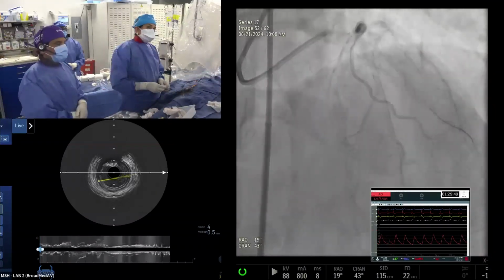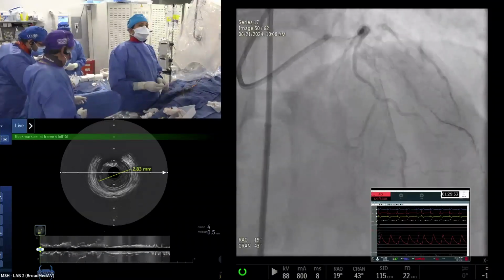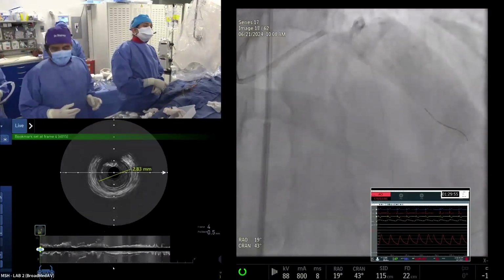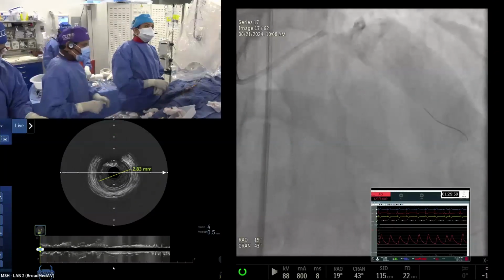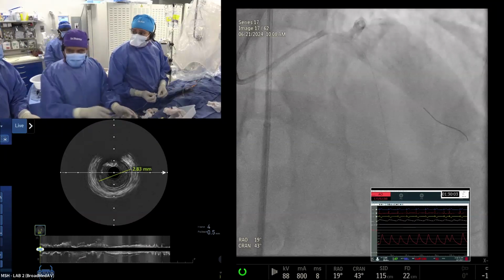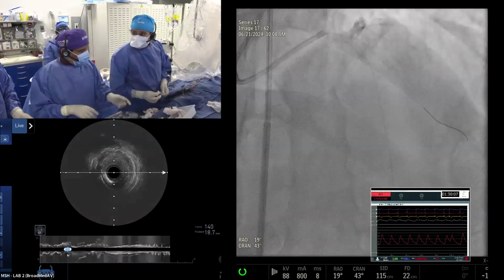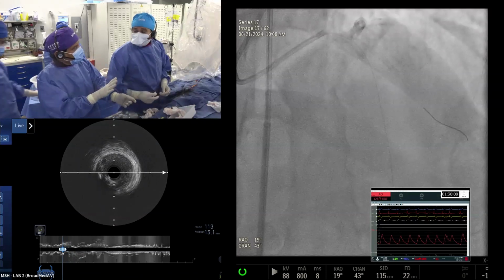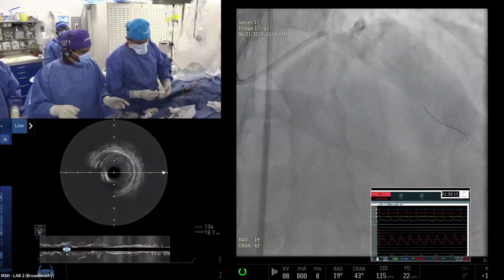I was wondering. Yeah, we have that actually. We opened it up earlier. The normal distal vessel is 2.8. Maybe 3 will be okay, approximately 2.75. Moderate pressure here. But what drug balloon do you have? 3 by 20 only? What's the shortest? 12. 12 is the shortest. So we need 20. Go.